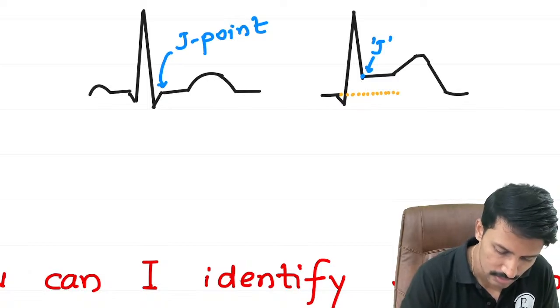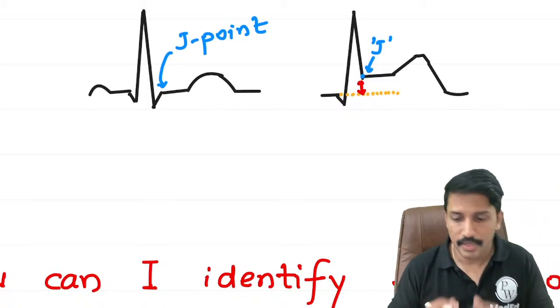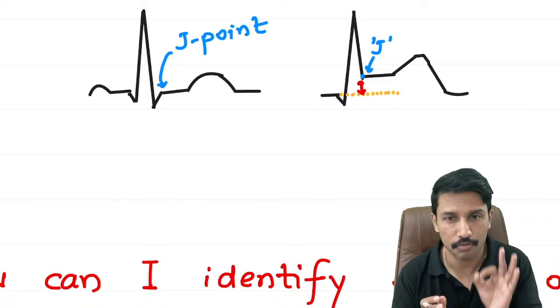Definitely we'll go through the real ECGs. First we will understand the concept. If I have to identify the ST elevation, first I have to identify the J point.